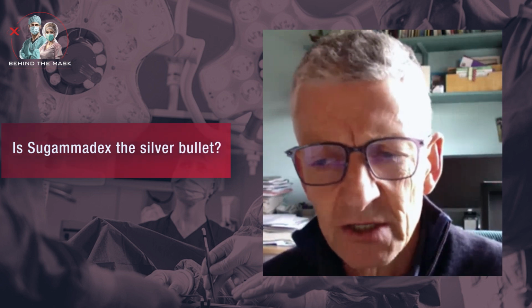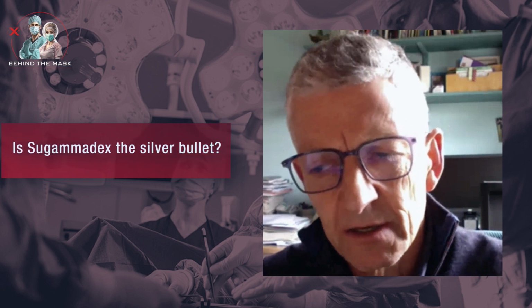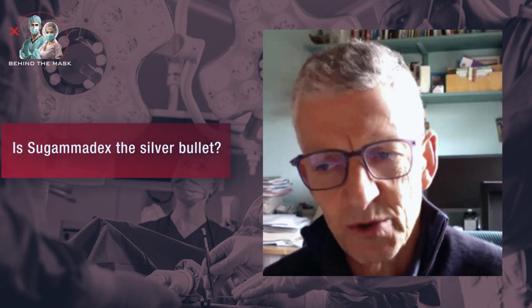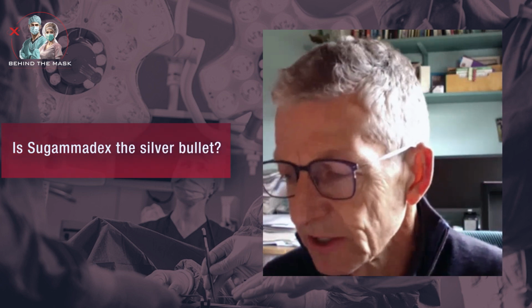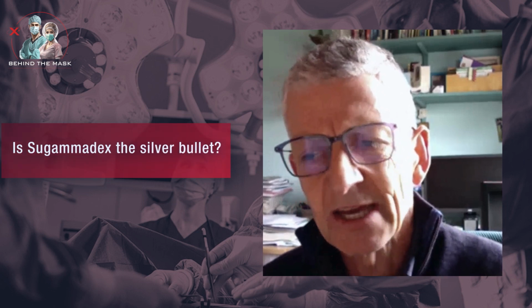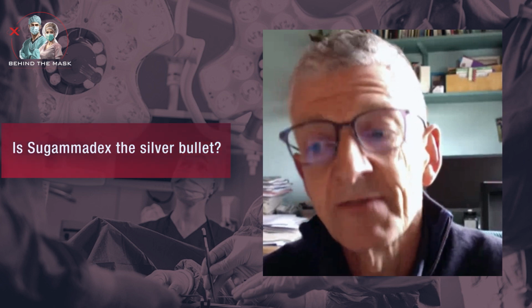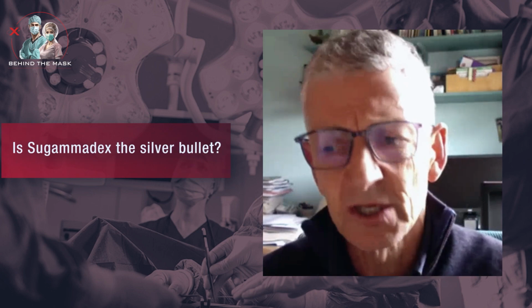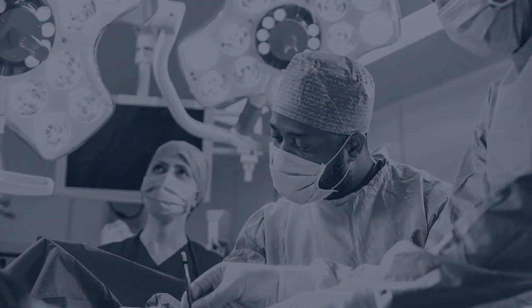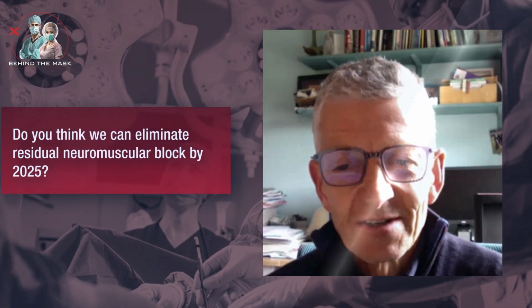appropriate monitoring and then the appropriate drug to reverse a patient, and then the certainty. The incidence of residual paralysis should be one that we should be able to set ourselves a target to eliminate in its entirety, and we cannot do that unless we monitor with a quantitative neuromuscular monitor, whatever the technology is, AMG, EMG, etc. Thank you. I don't know, but we have to set ourselves challenges and targets, and I applaud that.